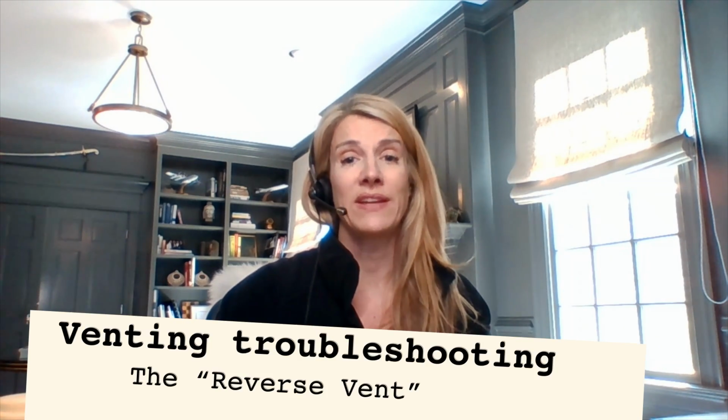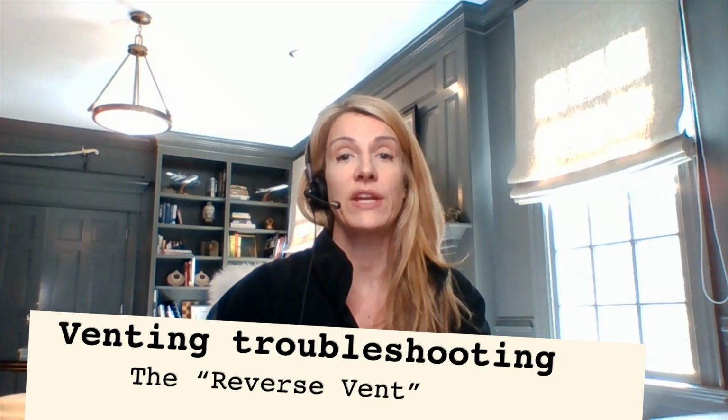And this gets to our number one troubleshooting technique for venting. And actually, you can use this trick for venting or feeding, which we'll talk about in another video. We call this the reverse vent because instead of removing the plunger and allowing the stomach contents or air to naturally flow back into the syringe, you're going to leave the plunger in the syringe and actively pull out some of the stomach contents. And you may find that fiber from the food or even mucus in the stomach can be blocking the flow of air or stomach contents from coming back out of the feeding tube.